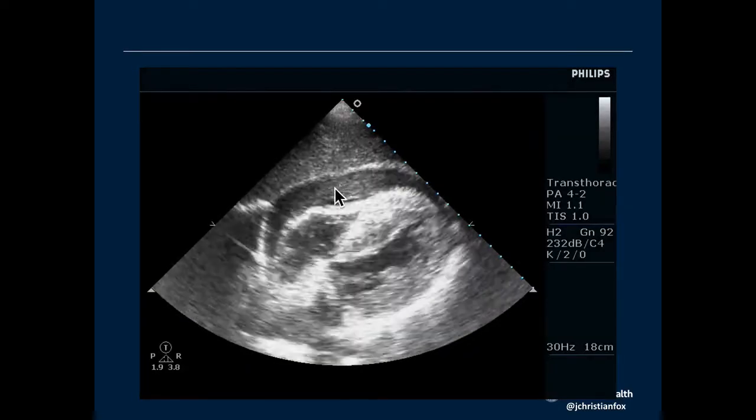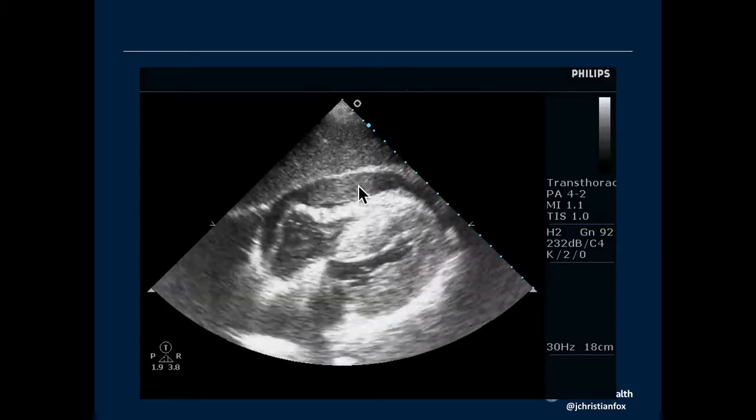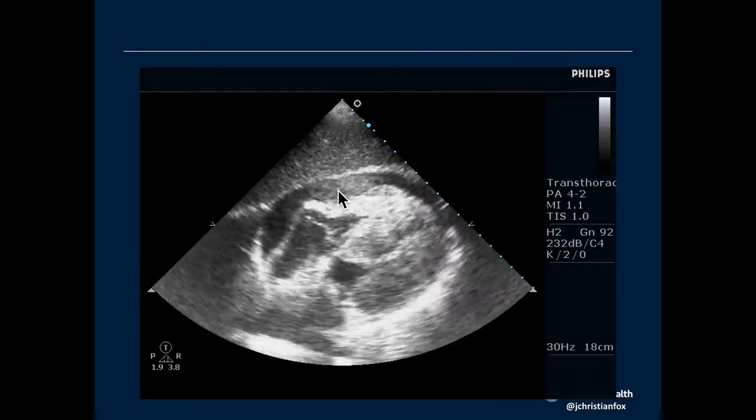In fact, there's clot here. This was a mediastinal gunshot wound. And so it went from the right chest across and exited the left chest. Bad wound to get, obviously. And you can see some clot here.